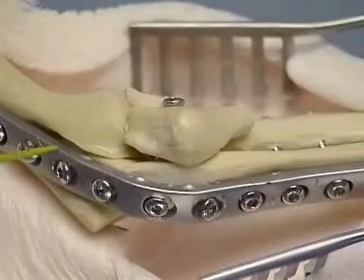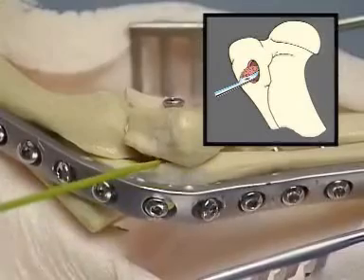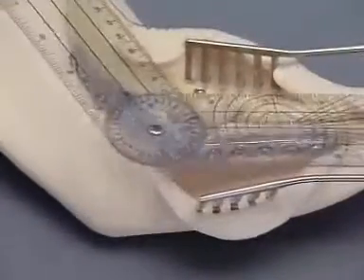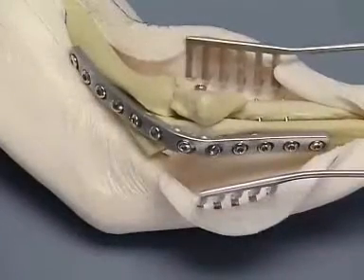In a clinical case, cancellous bone is collected from the proximal humerus. The graft is placed around the plate and arthrodesis site. The angles of the arthrodesis are evaluated critically and the orientation of the limb is inspected for varus or valgus deformity.